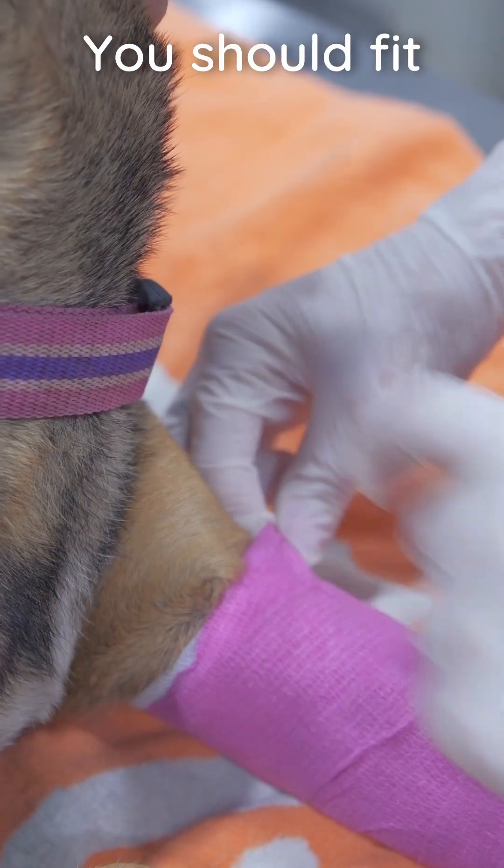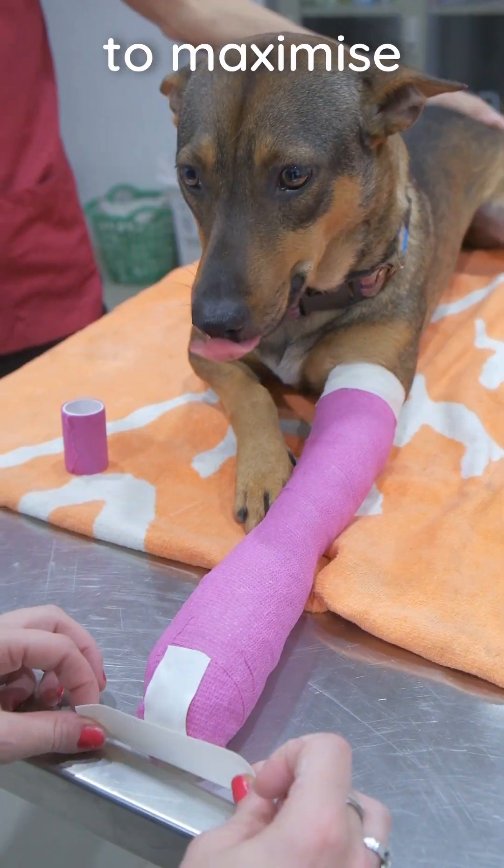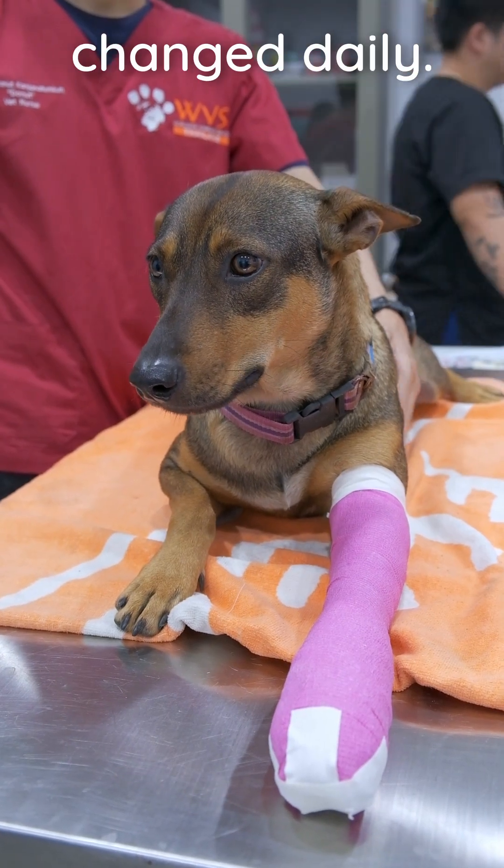Ensure the bandage is secure but not too tight — you should fit two fingers underneath. You may place tape at the top of the bandage and over the foot to maximize security and improve grip. Bandages may need to be changed daily.